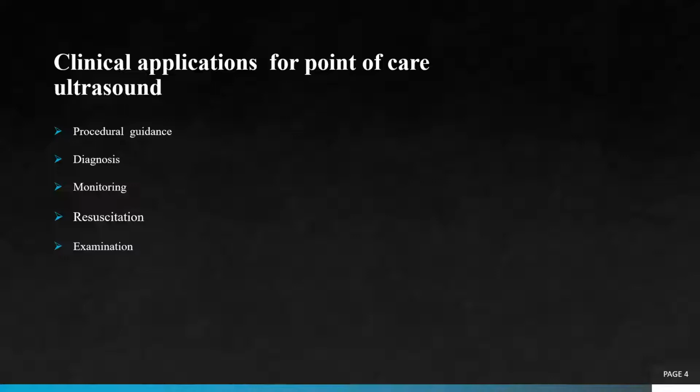Resuscitation. The use of ultrasound during resuscitation of cardiac arrest is a unique but underutilized application. Examination with ultrasound is likely to be beneficial because it is non-invasive and avoids ionizing radiation.